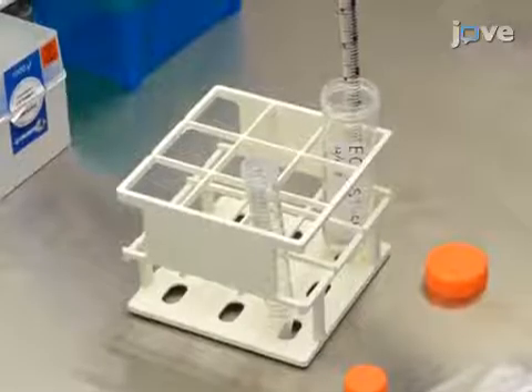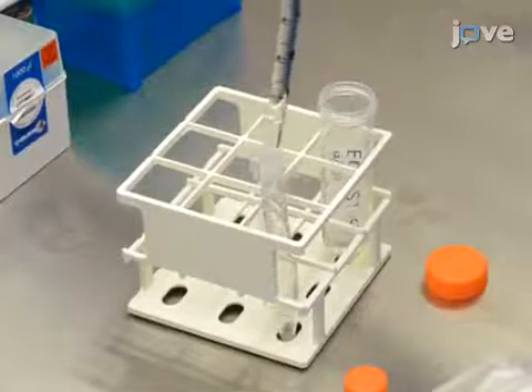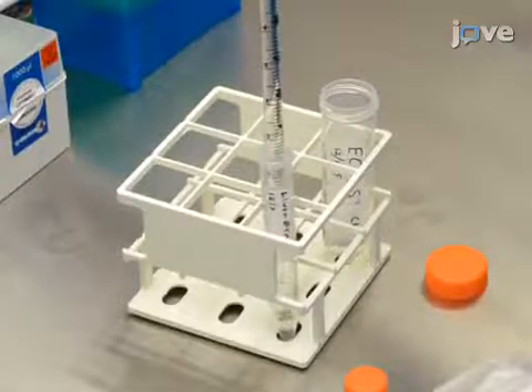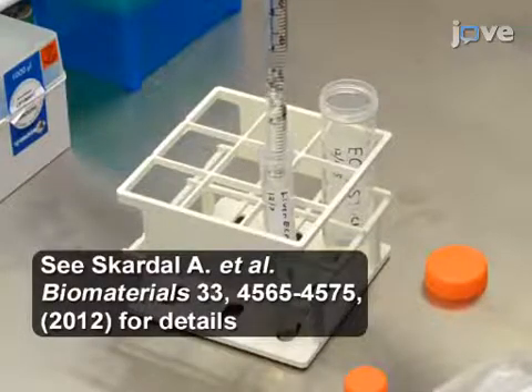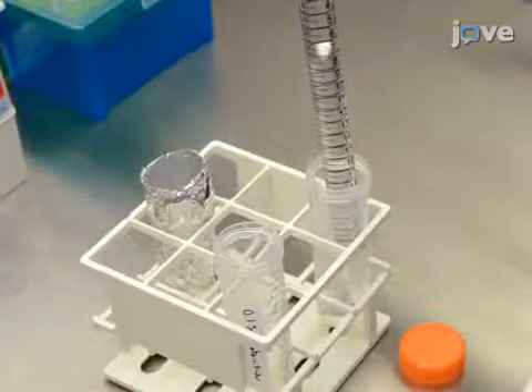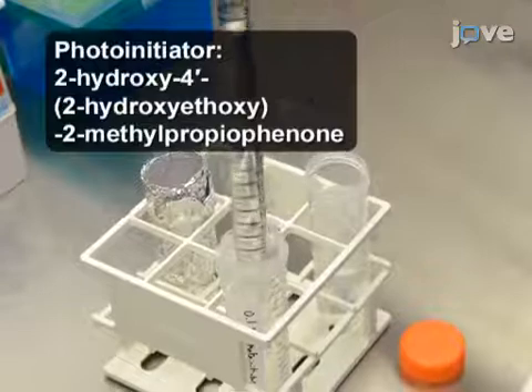To begin, prepare a tissue-specific extracellular matrix digest to be used in the hydrogel formulation as described elsewhere. Then, dissolve a photo-initiator in water at a weight per volume ratio of 0.1%.